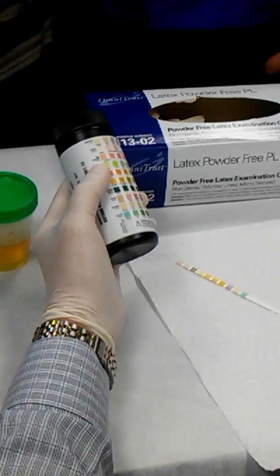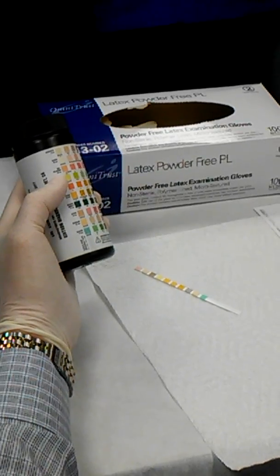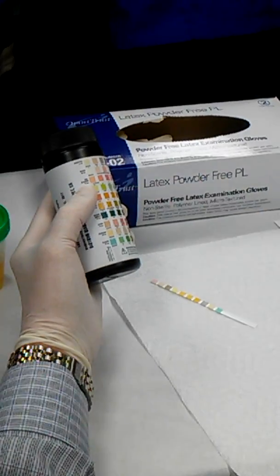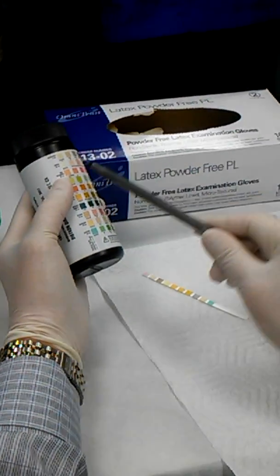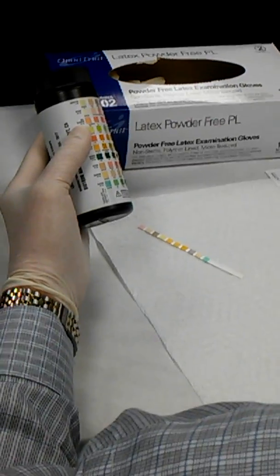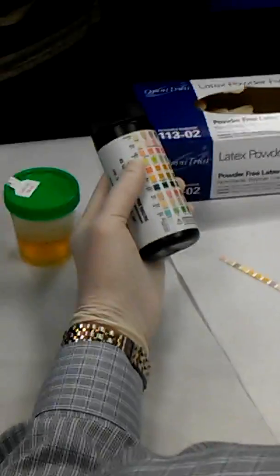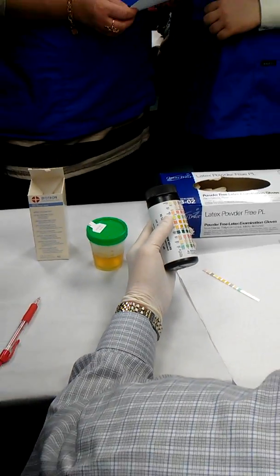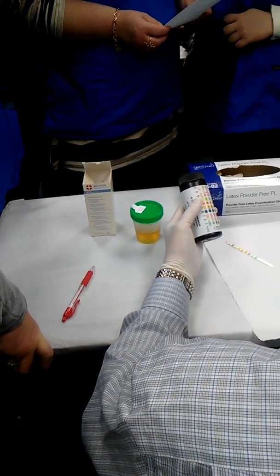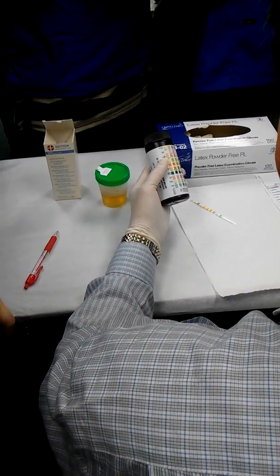Next is protein. You know, right? What is protein? Yes. What is here? Here it's not protein. It's urobilinogen. Number 3, it's urobilinogen. Urobilinogen will be present if a patient is developing jaundice. Of course, everybody in this room does not have jaundice, so urobilinogen should be negative. Urobilinogen is a substance derived from bilirubin. Bilirubin could be positive in jaundice too, number 9.